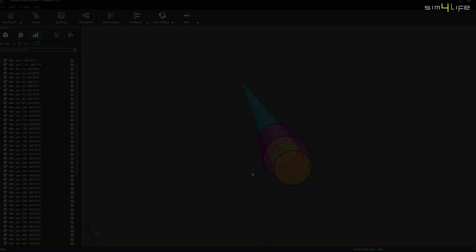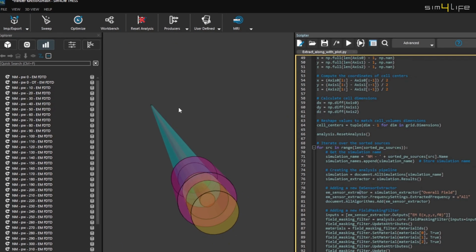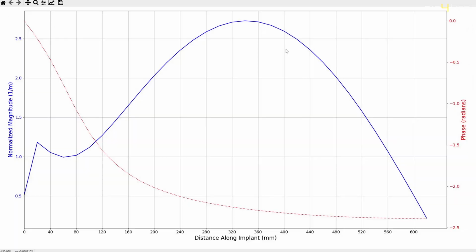In such a case, for the calculation of the transfer function, the above procedure could be repeated. This time, with the implant being placed in a homogeneous material with dielectric properties based on the length average properties of surrounding tissues. We now gather the results of the Tier 4- approach implemented within a homogeneous mixed medium. This approach is an intermediate step between the Tier 3 and Tier 4 procedures.